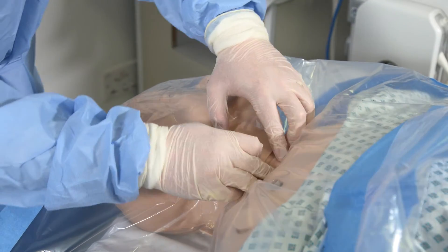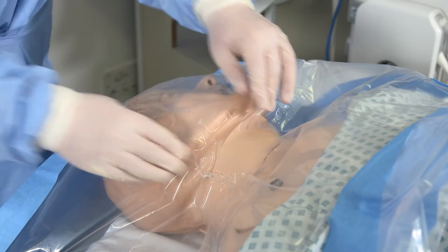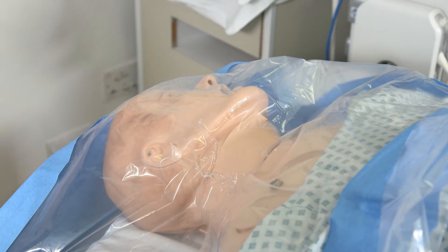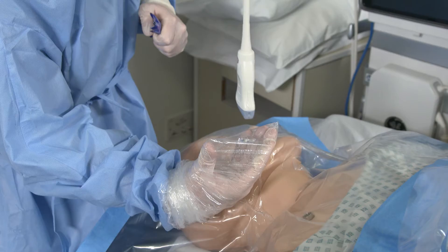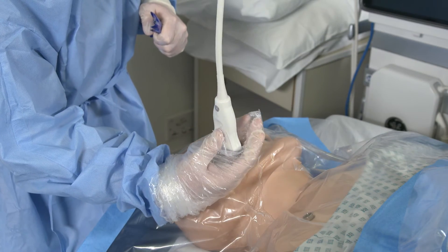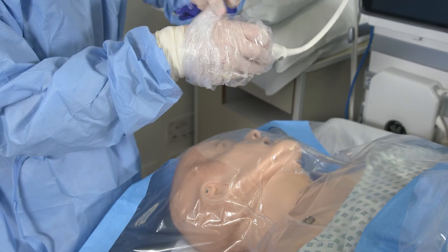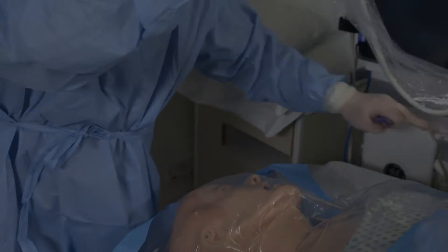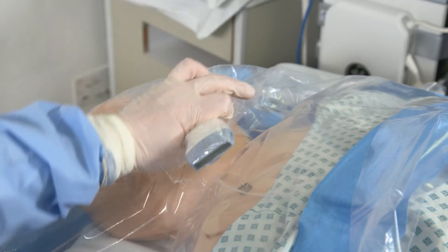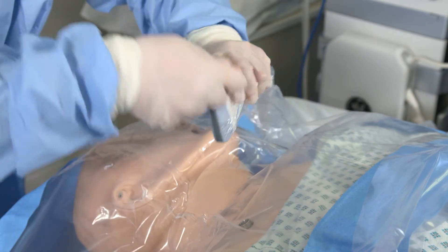It is important to warn the patient that this is going to happen because it can be quite an uncomfortable sensation. Put a small amount of jelly inside the bag and then get your assistant to dangle the probe in. Grasp it inside the bag and advance this over the tubing and secure it using one of the elastic bands in the kit.